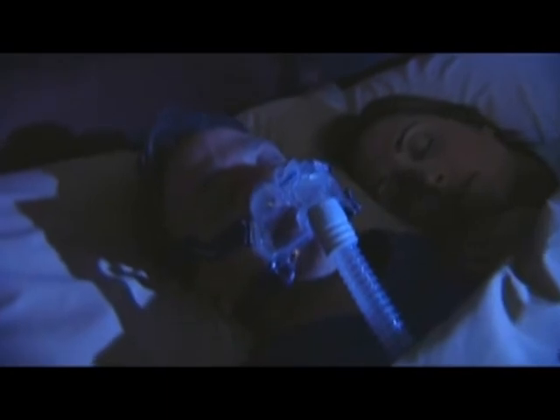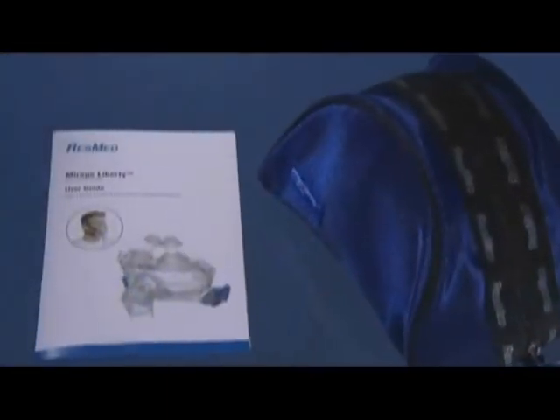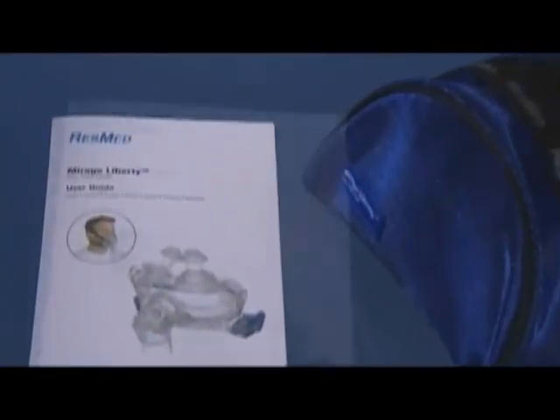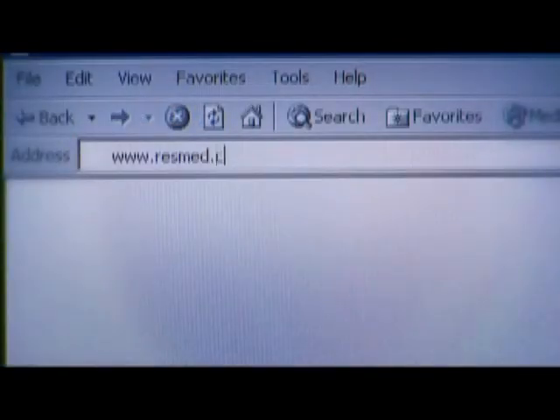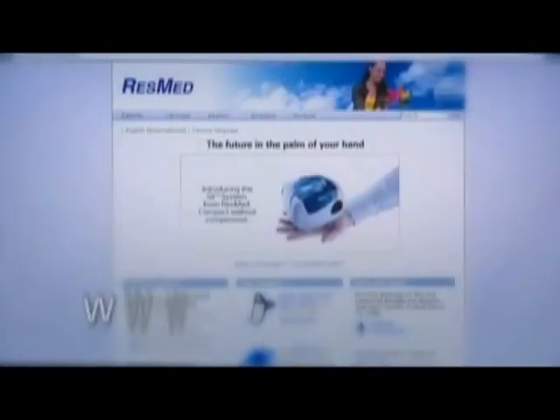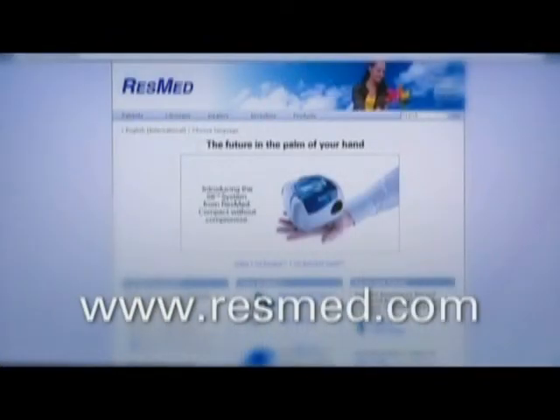With proper cleaning and care, your Mirage Liberty Full Face Mask should continue to provide you with optimum treatment and the highest level of comfort for you and your partner. For more detailed information, please refer to the user guide packed with your Mirage Liberty. To learn more about ResMed products and accessories, visit our website or contact your healthcare professional.